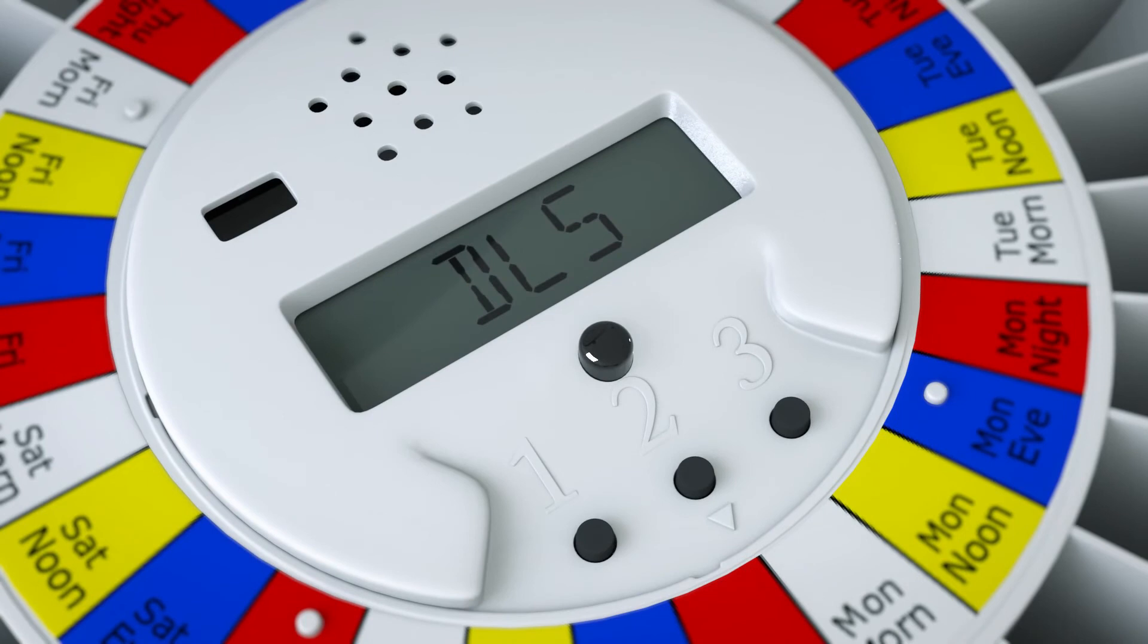Press button 1 until 'start' is displayed. Wait a few seconds and 'yy' will be displayed. Set the year using buttons 2 and 3, then press 1. 'mm' will be displayed. Use buttons 2 and 3 to set the month, then press 1.